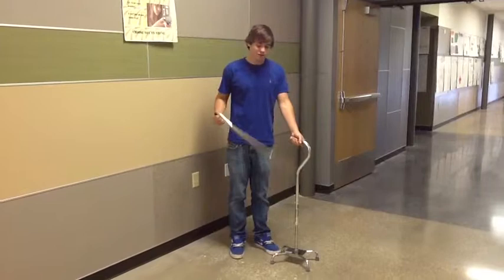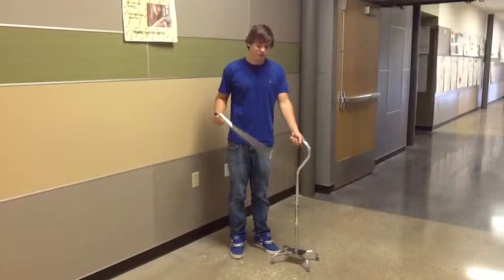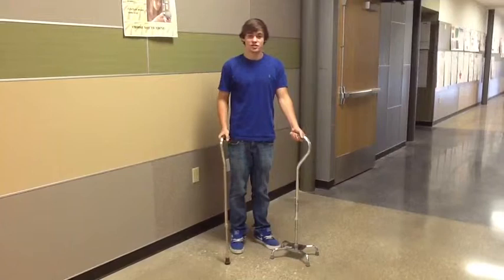Choosing the appropriate cane is important. You can go with a single tip, and this is used for just balance. But if you have to bear your weight, maybe due to an injury, you can use the foretip.